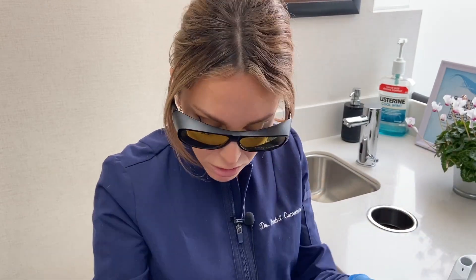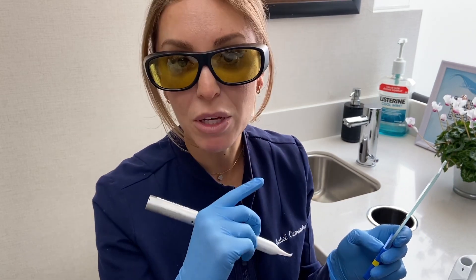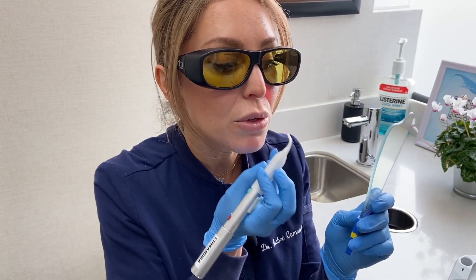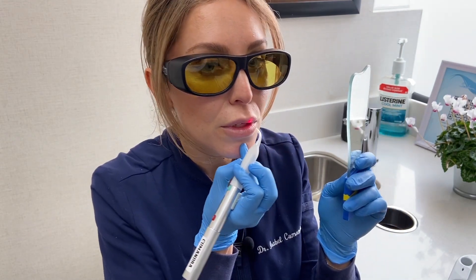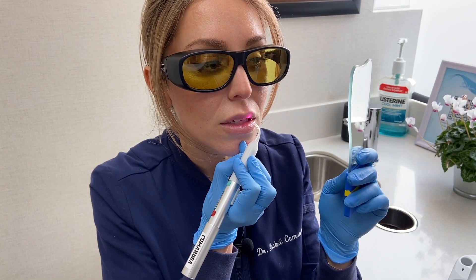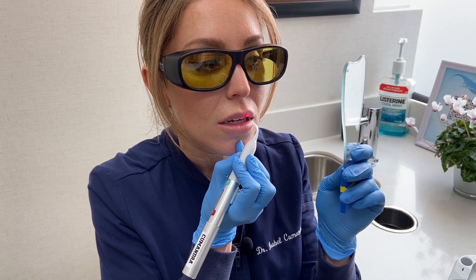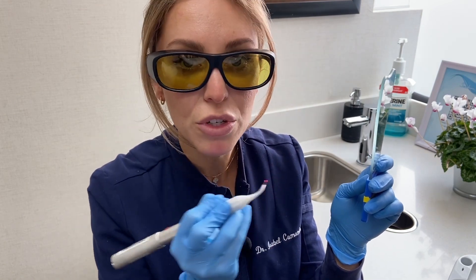So I'll quickly demonstrate, and then I'll let you know what it feels like and what you can expect. What I will do when I'm activating it — I'll start at about five millimeters away, and you'll see me making circular motions. I'll come a little bit closer to about two millimeters away, but I will never actually touch my lip at all. So let me start about five millimeters away, and I'm going to activate it, and then I just do circular motions.